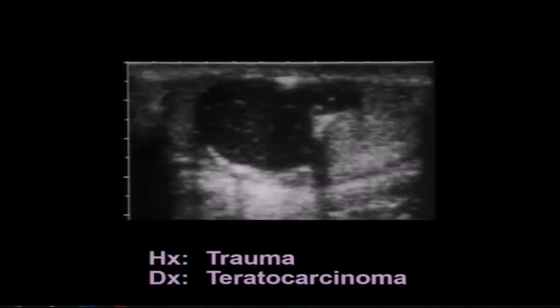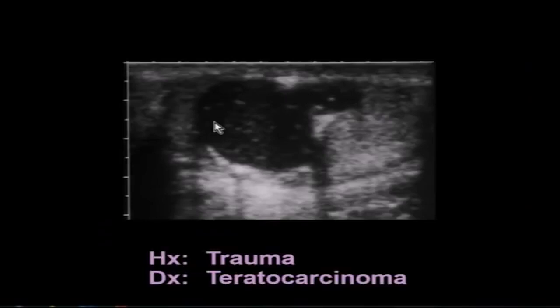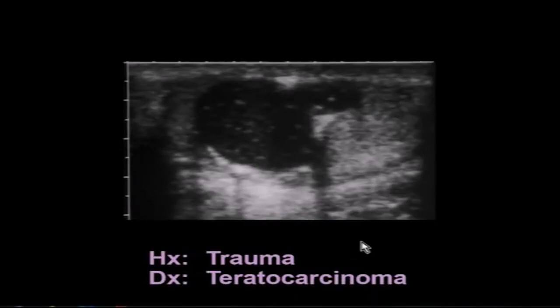This patient came into the emergency room after trauma. His scrotum was scanned, and we can see normal parenchyma in the lower pole but a hypoechoic area with calcification in the upper pole. It was questioned whether this was a hematoma, but it is not — it's a teratocarcinoma.